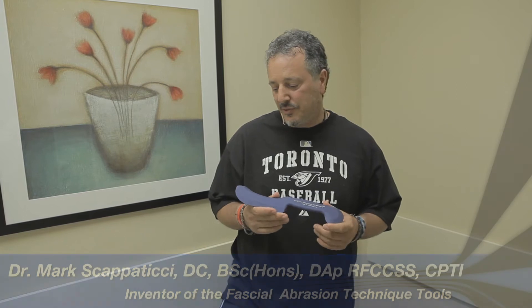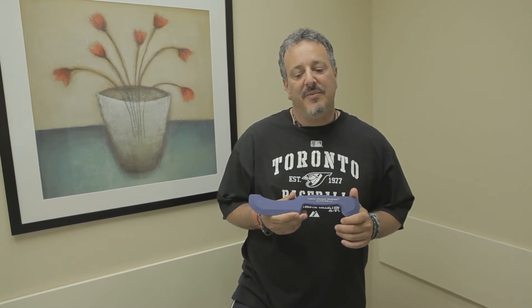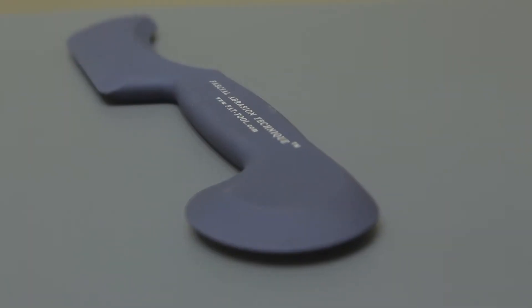I'm Dr. Mark Scappettici, the developer of the fascial abrasion technique tool. This tool here is the sports model. It has been specifically designed for personal trainers and strength coaches, as well as for people assisting healthcare providers when working with individuals and specifically athletes.